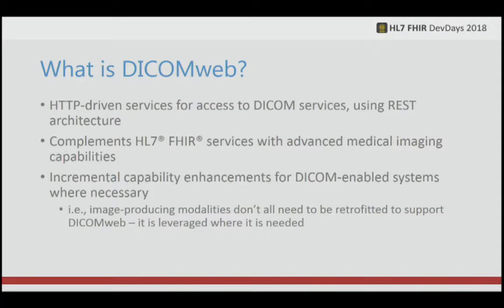Because if you think about what's different than moving from HL7 v2 to FHIR, you're just representing the data in a different way on its way in and out. But DICOM, because it defines the structure of the file, it's not like we can go back over terabytes of data and somehow rewrite it into a different format or somehow expose it differently. With DICOMweb, we actually open up the doors to access the DICOM images using something that's friendly, that's RESTful, that people use today, but keeping that connection to the legacy as well.